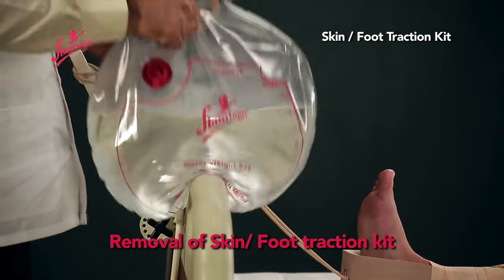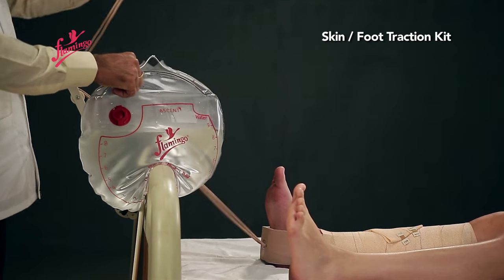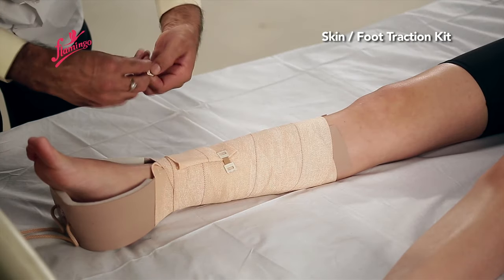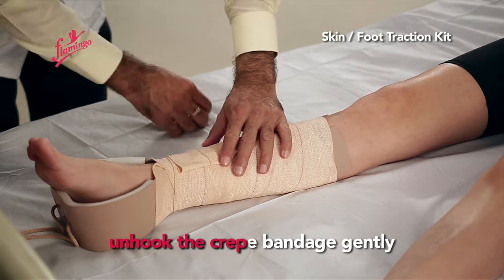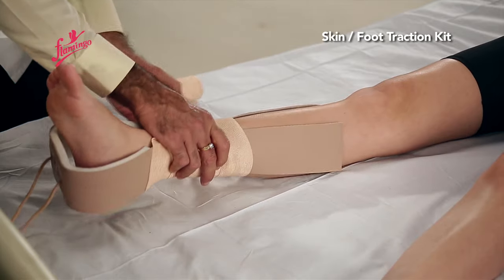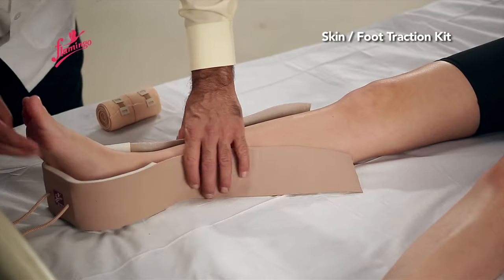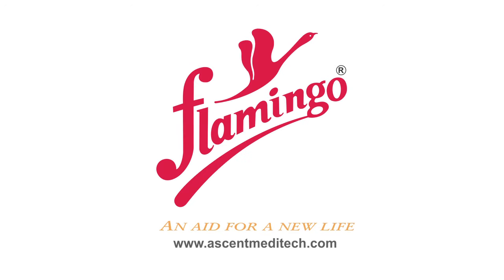Removal of Skin Foot Traction Kit: Remove the Water Weight Bag, then unhook the crepe bandage gently and remove as shown.